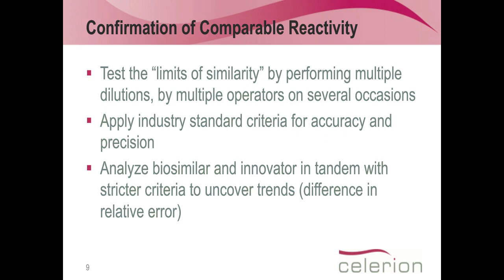And then we basically measure the QCs of both compounds again on a plate. So that looks very similar to what you have seen before.